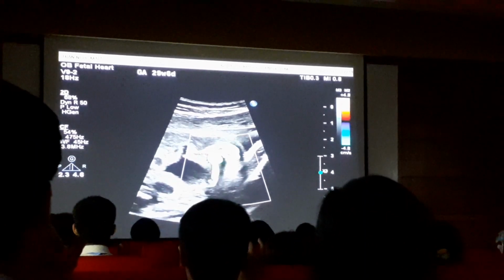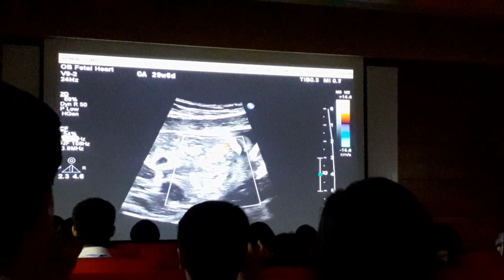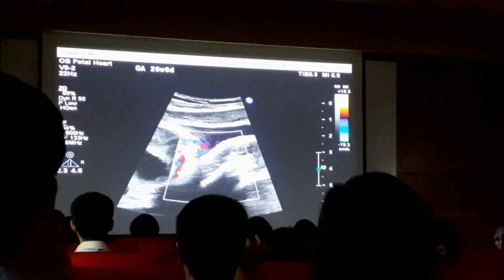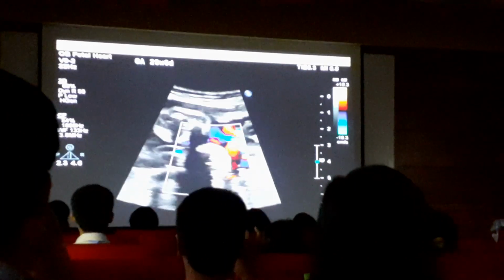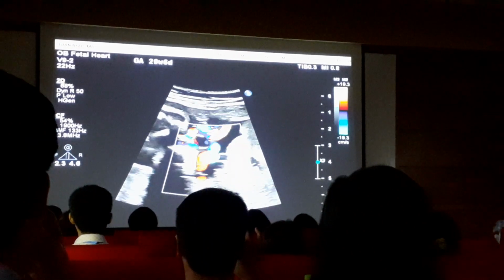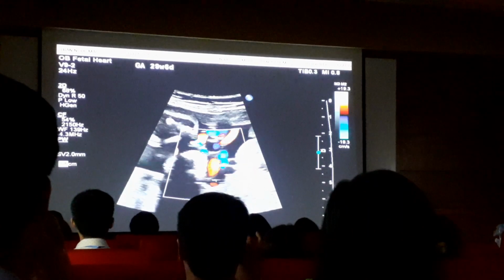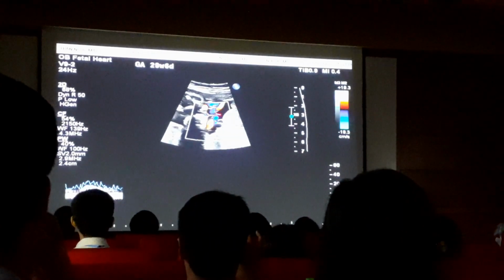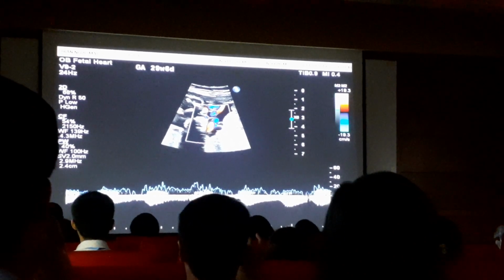Demonstrating two umbilical arteries. So hai cái động mạch rốn đi rất là rõ. And then normally I would do the biometry, but again I'm not going to do that. Thường thì cô sẽ đo theo cái một số chỉ số về sinh trắc này, nhưng mà thôi cái này không cần. Free floating loop of umbilical cord. Tắt nó đi.